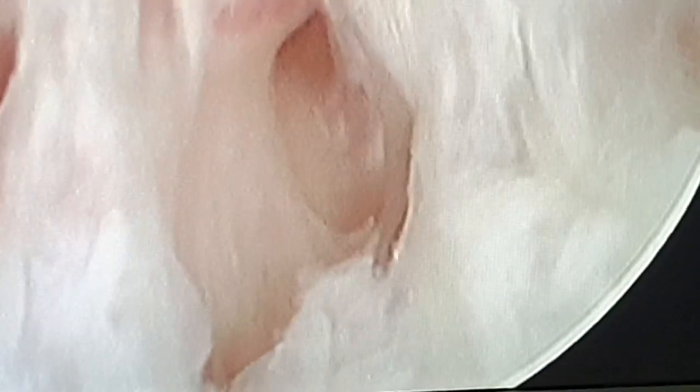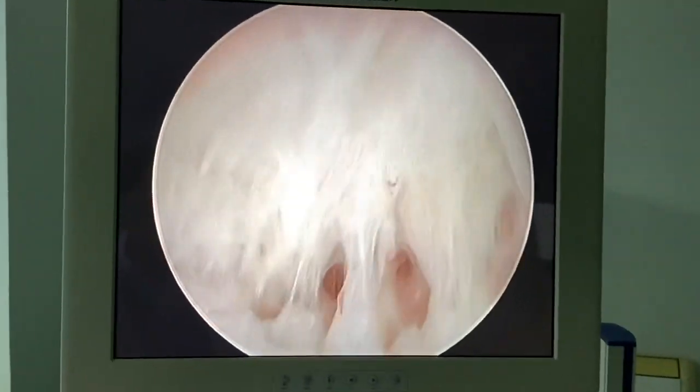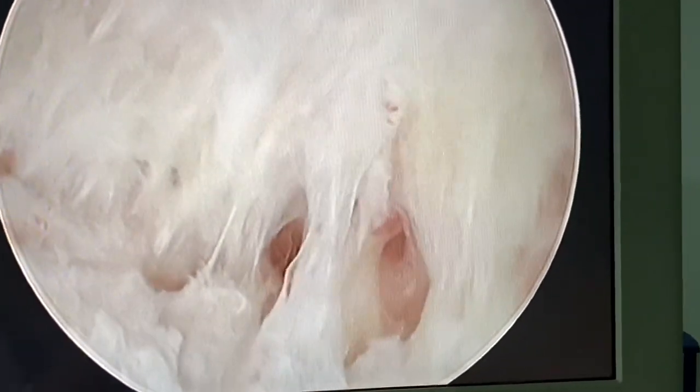I will show the pulsation to you. This is a blood vessel and this is the fundus myometrium. You can see the pulsating vessels — like a flasher. This is the pulsating vessel. And this is the tubal ostium. Always adjust the focus.